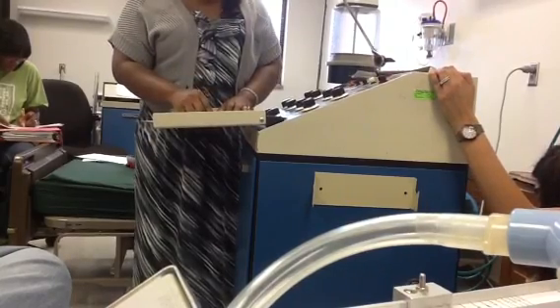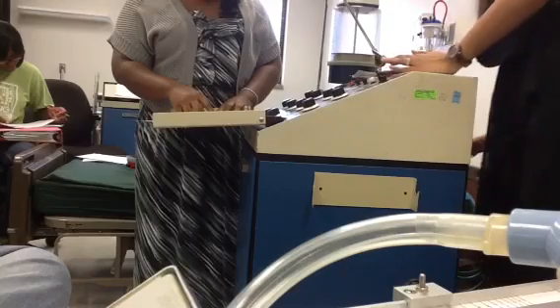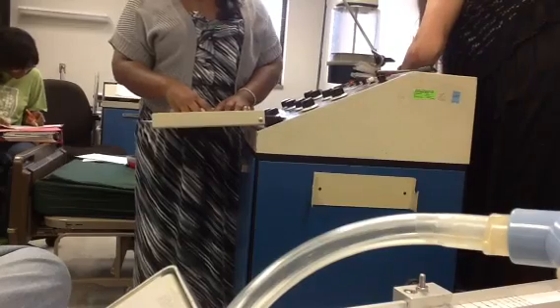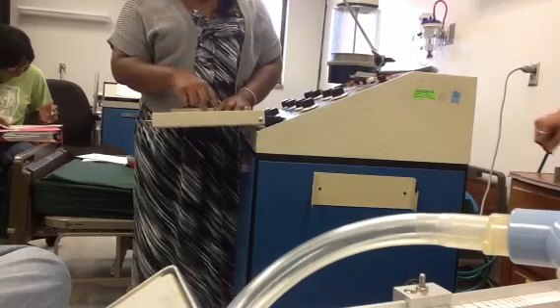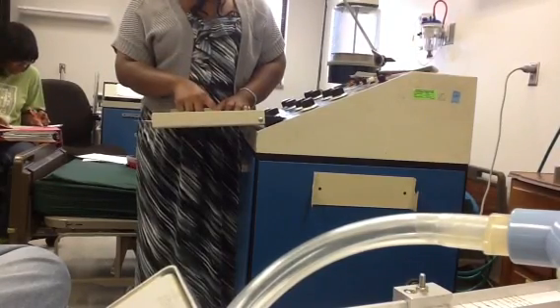Then you have your tubing compliance factor. And under that, from volume loss all the way down to high pressure alarm. High pressure alarm will be the first alarm. So down to static compliance will be your last one. These are all patient parameters. So this is what the patient's actually doing.